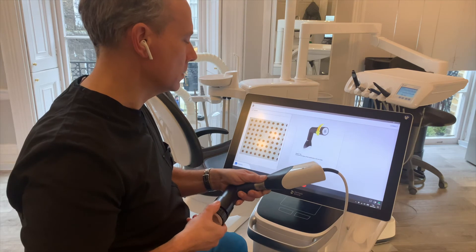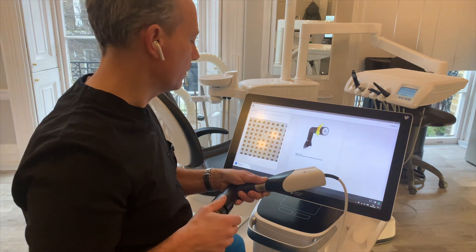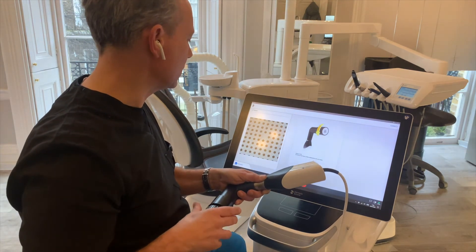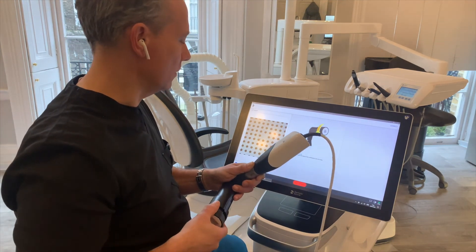Capturing, unscrewing, capturing — you can see this is actually quite a quick procedure. Normally one of my nurses does this on a very regular basis, so we don't have to worry about it. But it is something that can be overlooked because it doesn't prompt you to do this all the time.